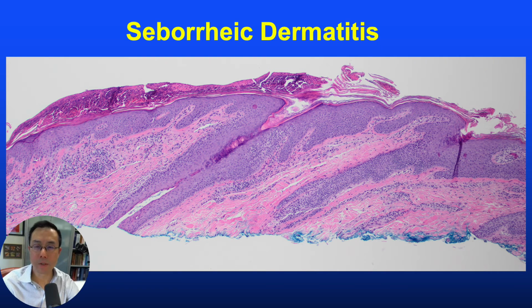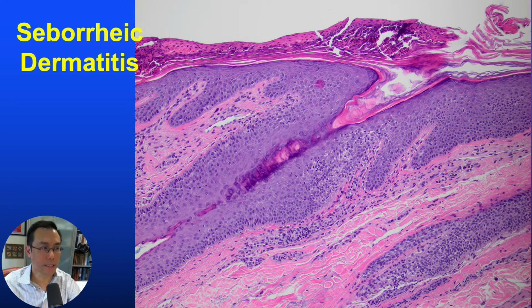And another example, again typically from hair-bearing area of the scalp, now with more extensive neutrophilic crust extending well beyond the shoulder. And we can see the spongiosis is accentuated at that angle of the epidermis and hair follicle, and even the overlying crust, although diffuse, seems somewhat more prominent and thick at the shoulder.